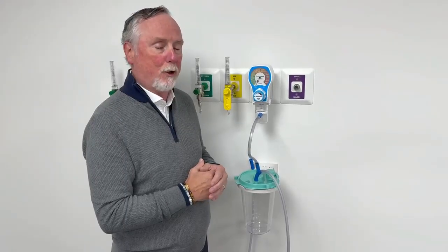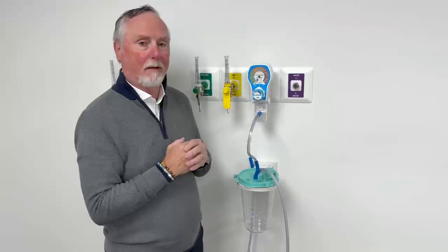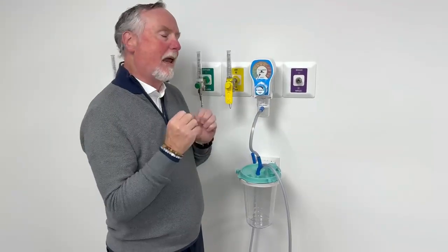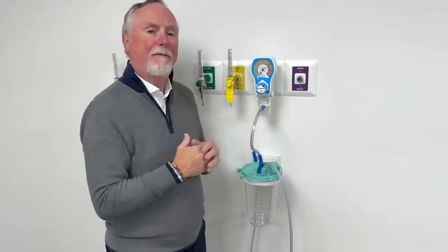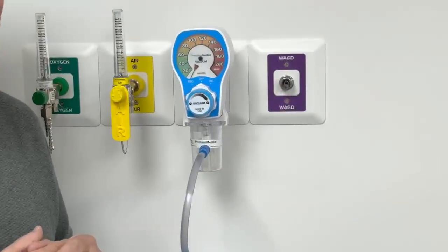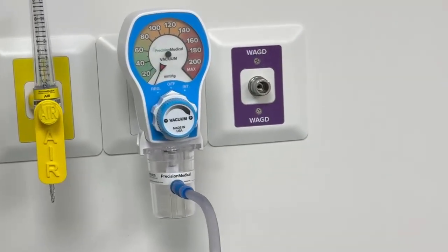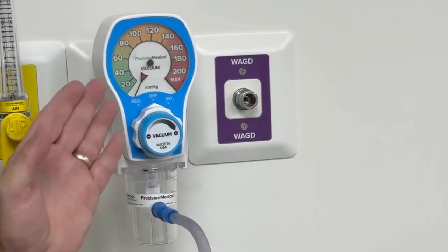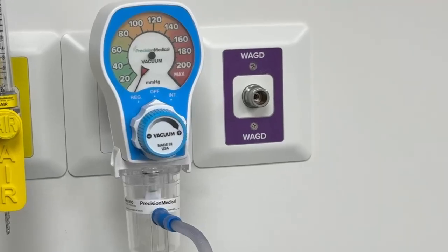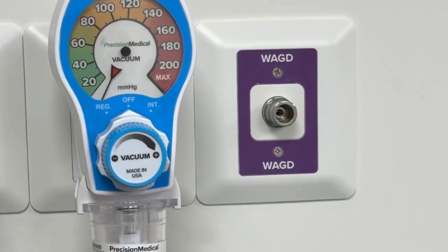I'm going to introduce you to our new Precision Medical PMX model vacuum regulator and PMX 900 model filtered vacuum trap. The 'X' stands for extra visibility with the vacuum regulator. The gauge is much larger from a patient safety standpoint — when trying to view this from a distance, it's much easier to see the gauge and where vacuum may be reading at that time.